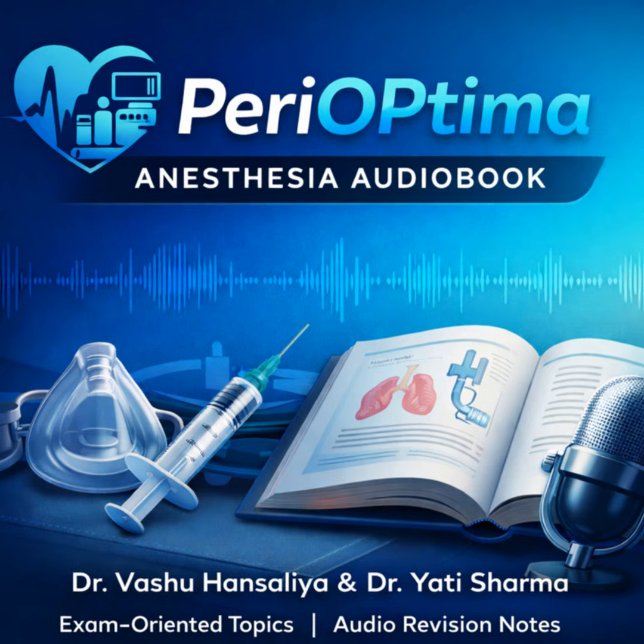You'll default to a Macintosh size 3 or a Miller size 2. The choice between curved or straight often just comes down to personal preference and what you're most comfortable with. But the moment you anticipate a difficult airway, the standard of care shifts immediately. You should be reaching for an indirect device. That means having a video laryngoscope, a flexible scope, or an optical stylet ready to go. If you absolutely have to use DL, you should at least be using a modified blade like the McCoy.